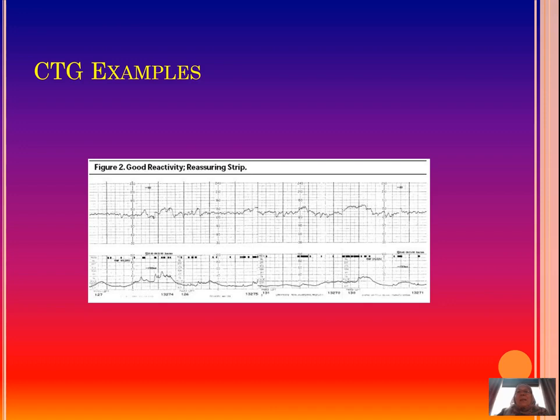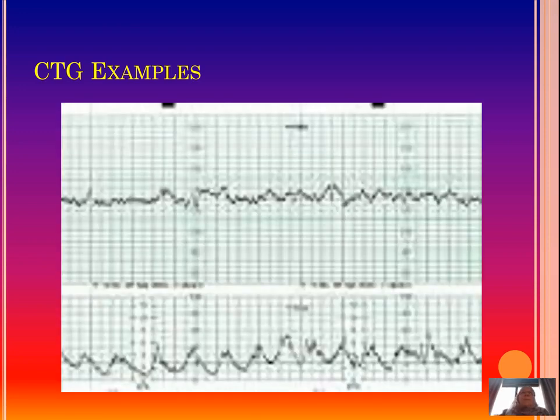It represents the same mechanism as when you go to the bus, taking you to Emirati Hospital in the morning, and you find yourself late, so you run a little while to the bus. Then your heart rate will also be fast when you reach the bus, and this is the same for the fetus here. The fetus, when it moves, translates into a tachycardia, a little boost of increased heart rate.